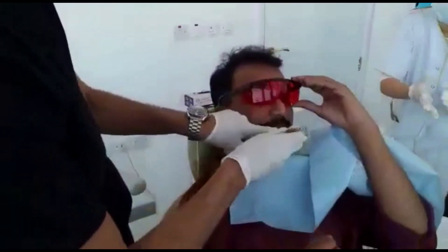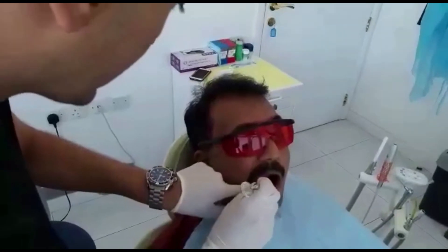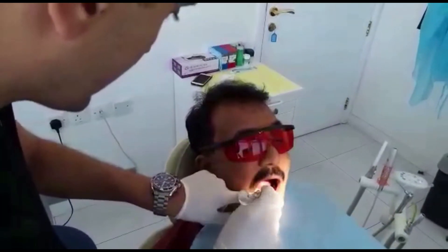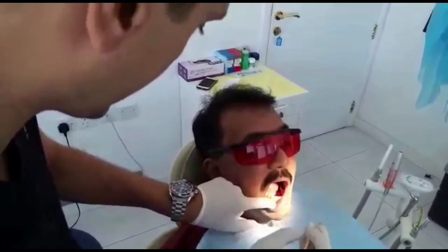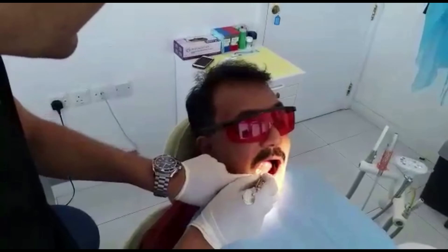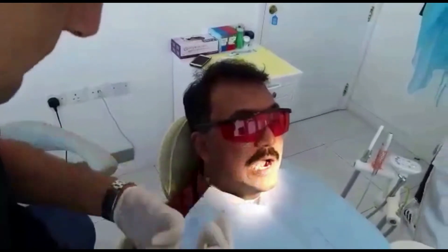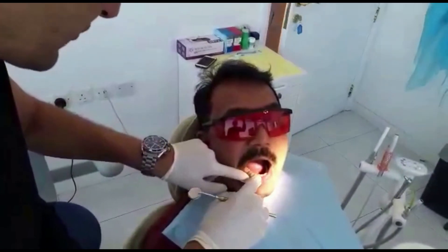You have to tell me your experience. If I want to make sure... partially on teeth five, maybe five or three, but four, three — it's good. I think four or three will be fine. I only gave a quarter, but I can work now. I'm sure I can work for like 10 to 15 minutes for teeth five, four, three. If I give one carpule, I can work partially for teeth five, four, three, two, one.